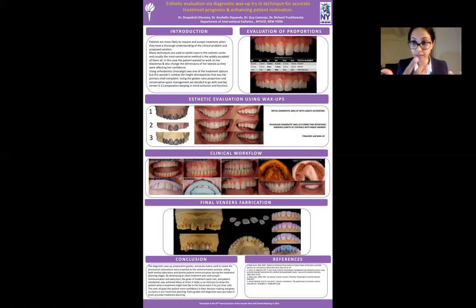Since she was very detail-oriented, she wanted some changes. Finally, we made an alginate impression which we sent to the lab. This is her rest position. The idea behind this technique that I found very interesting is that it gives a lot of say to the patient and gives them more confidence when you show them a predictability of what the final treatment might be.